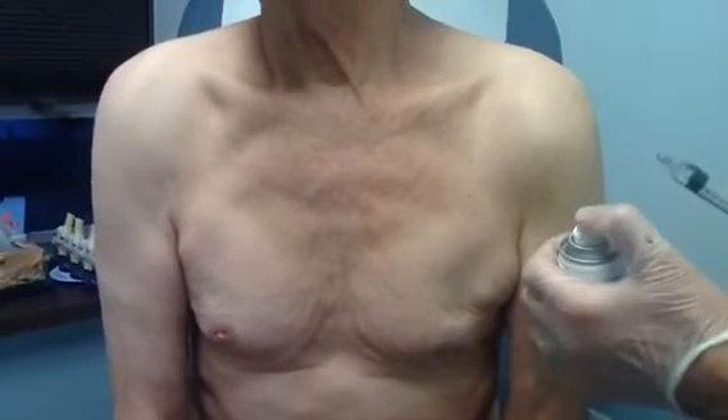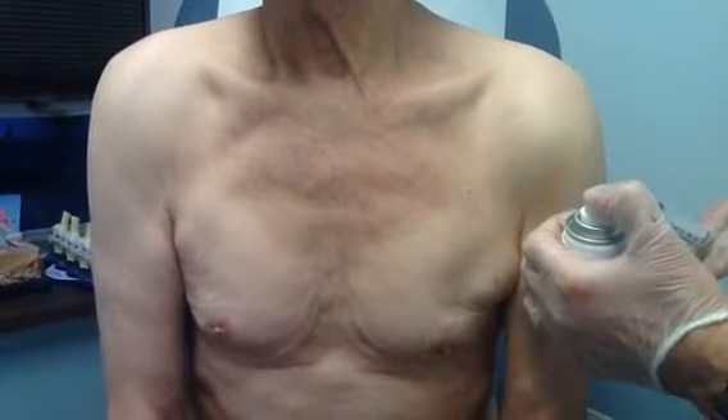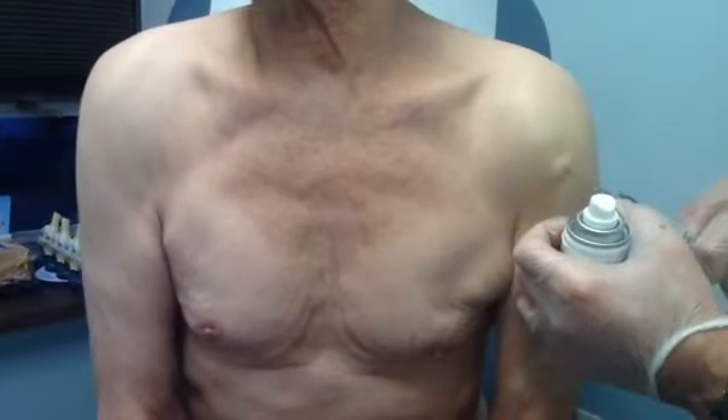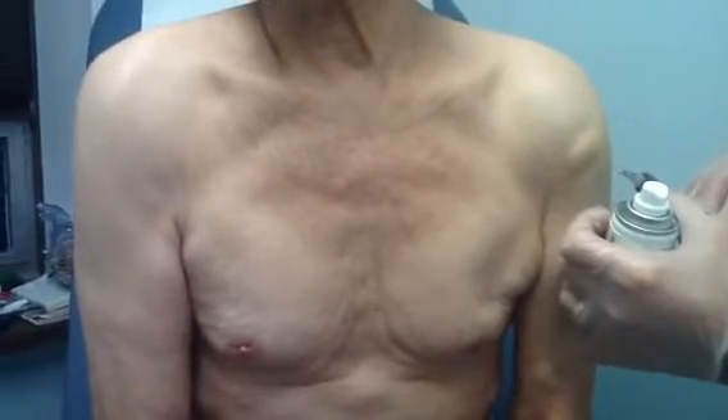So what we do here — that's the numbing, this is the numbing. How is it? Okay. So this is the local numbing.